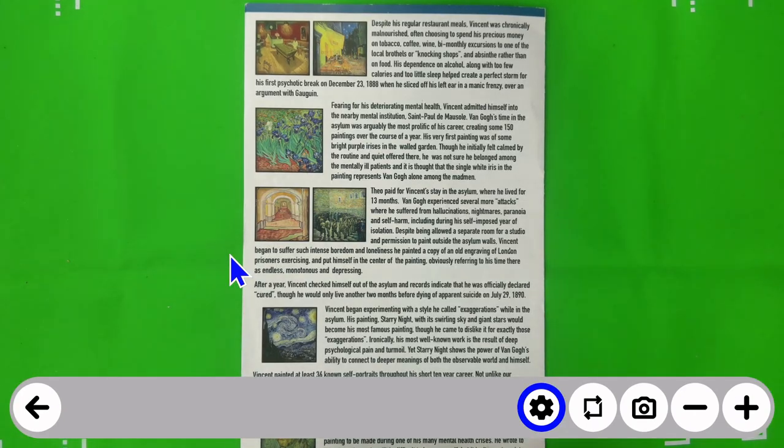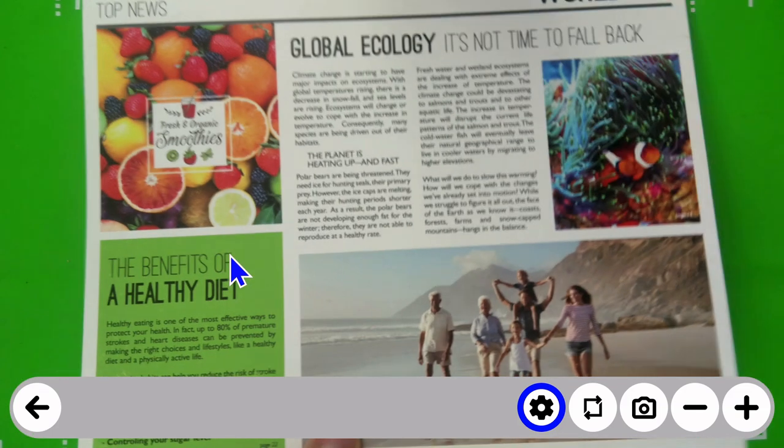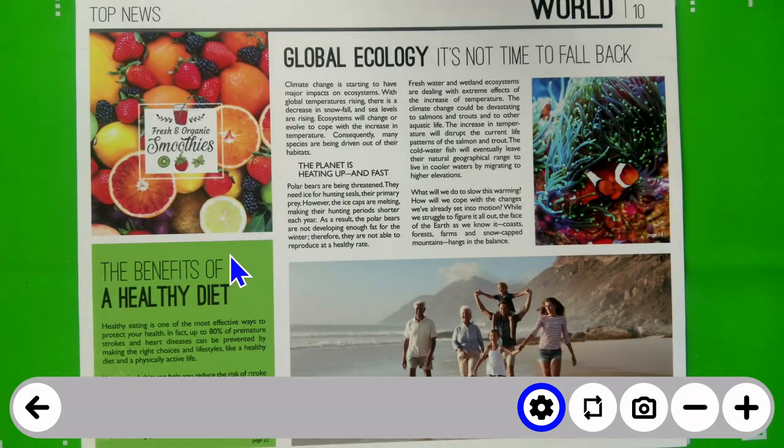And now I'm in a live viewing mode and my toolbar has changed so that I am going to be able to basically do one capture at a time instead of a multi-capture. So this is an overview of capturing documents with Prodigy for Windows.